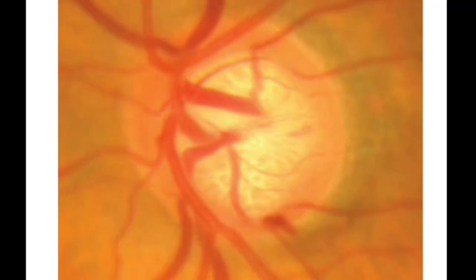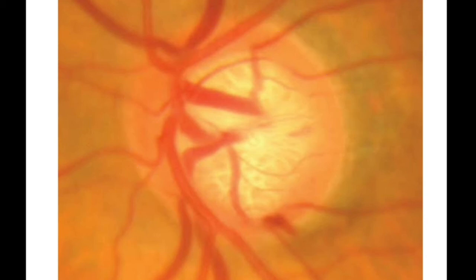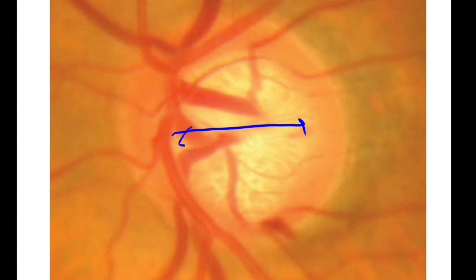Before going to the discussion of the next part, the peripapillary area, let's see what changes are seen in this disc. This is the optic disc. Measure the size and shape of the optic disc. The optic cup, again measure the size and depth. Here the CDR, the cup disc ratio, horizontally is around 0.6. Vertically it is also almost 0.6, but there is inferior notching as you can see in this neuroretinal rim.